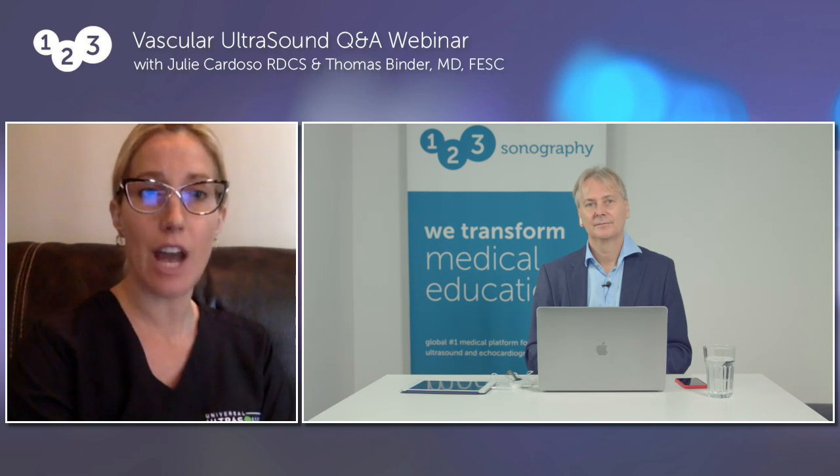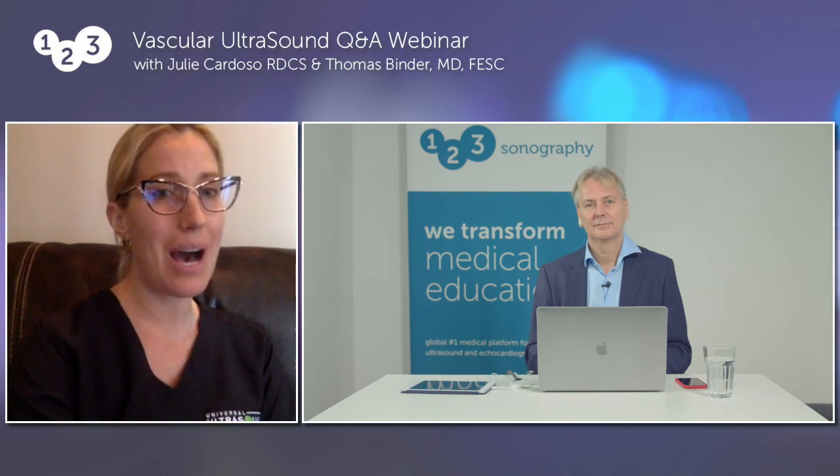Okay. Just a question. Would you ever use contrast? Well, we are just getting into contrast for vascular. We particularly don't really use it right now because we are pretty sufficient as far as documenting our vessels with B-mode, color flow, and Doppler, but we have used it in some cases, with patients with higher BMI. Because you want to prevent the patient from going to the angio suite to get exposed to radiation if possible. We want to get that clinical question answered if we can by ultrasound.